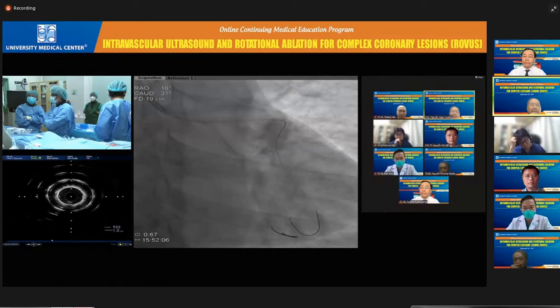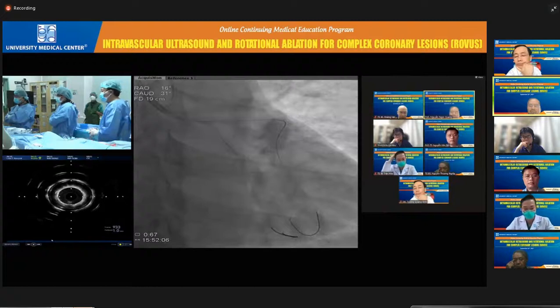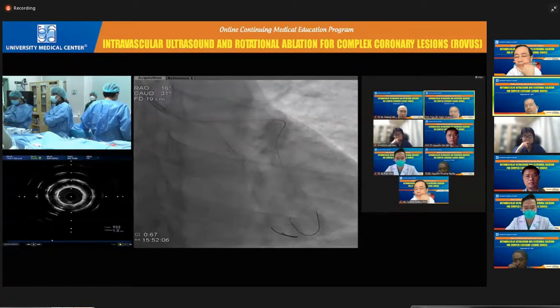So that's why you need to optimize the stenting of the LCx ostium, and why I don't want to jump very quickly to the kissing balloon. Slowly, because I don't want to increase the size too much and deform the stent. What do you think about that, Dr. Kuramisu?